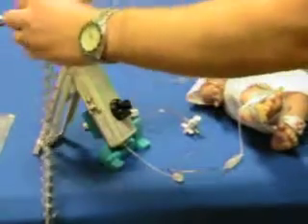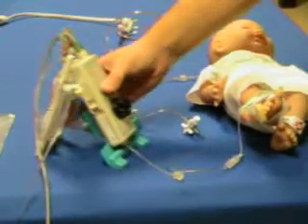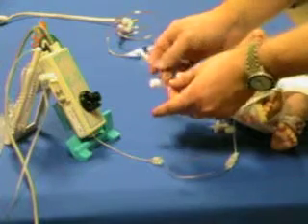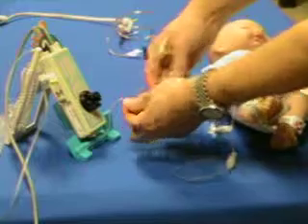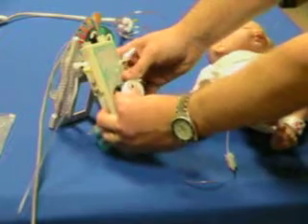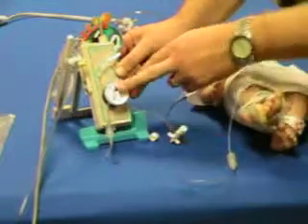We'll prop the sensor holder up like this. What I like to do is take the curly Q tubing and put it over the post. And then you've got two more connections that aren't primed or anything, but the monitor is going to do that. You've got the sensor in the bag, so we'll go ahead and connect the sensor. Each of these are labeled, by the way. We'll go ahead and pop this into the holder, and it's going to go into the 12 o'clock position. Should fit right in there, and you should hear a click once you get it secure.